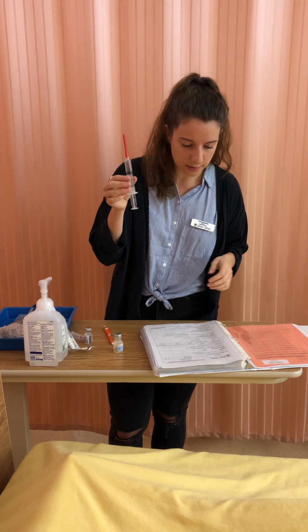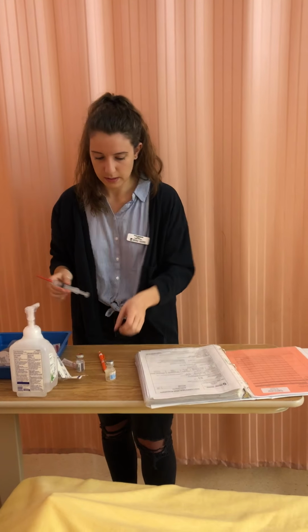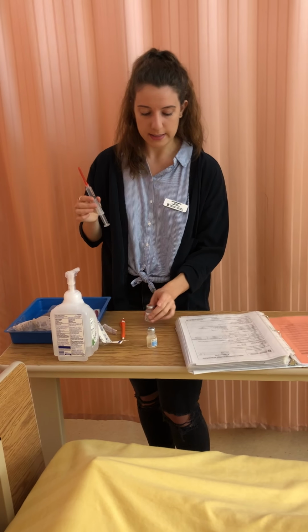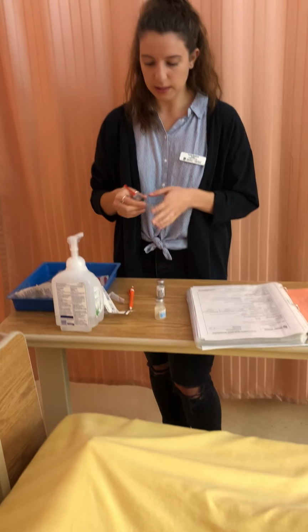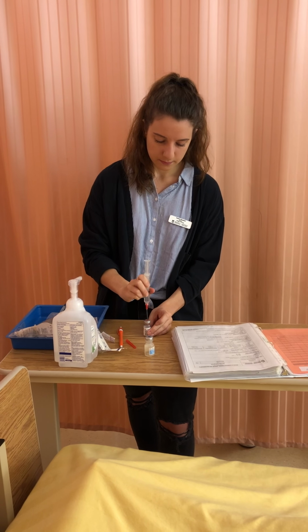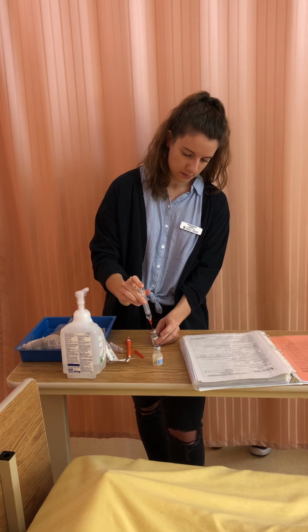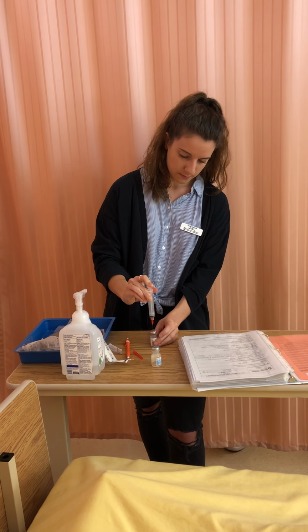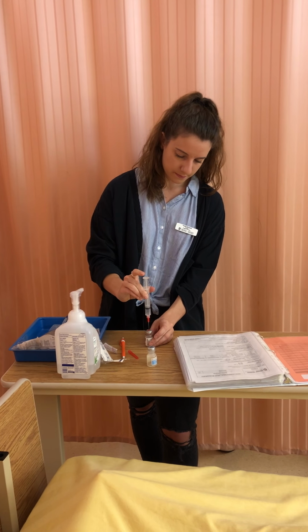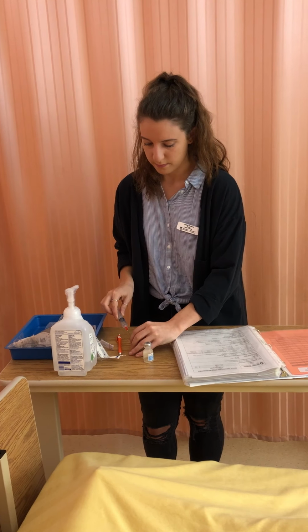Okay, so I have 4.8 milliliters of sterile water in here. I'm performing hand hygiene, and I'm doing a general safety check. So now I'm going to put this into my drug vial. It is still clean, I have not touched it. Side rails here, and I'm going to inspect my primary bag here. Primary bag's good. And I'm going to let the air out. And it's running at the correct rate. I'm going to introduce myself. Hi, my name is Destiny.